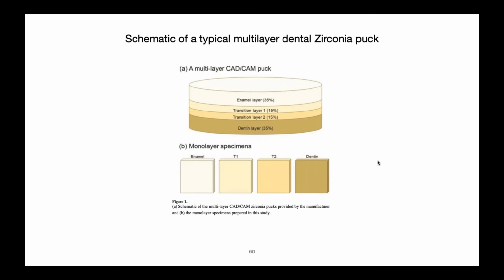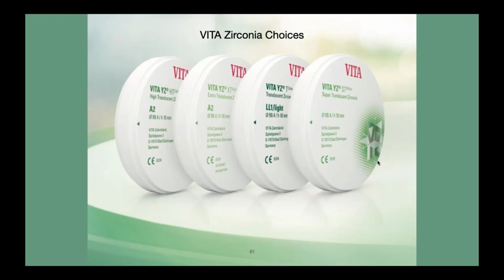And they look opaque because some of these pucks use different zirconias within the same puck. And this is very dangerous because you could have 3, 4, and 5Y zirconia within the same puck. There's a limit because there could be tension built up within these layers, because the firing temperature, as far back as I remember, of 3Y zirconia is different than 4Y or 5Y. So I don't know. I like to stick to something that's more basic.